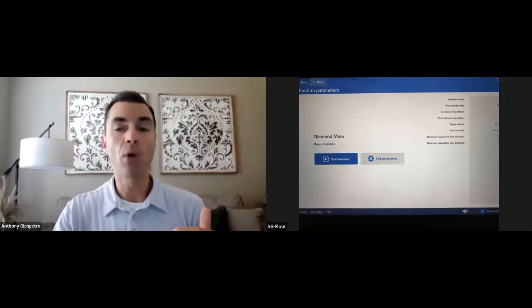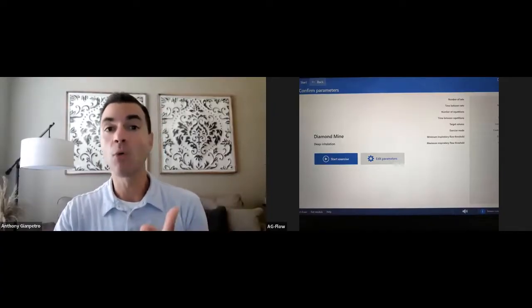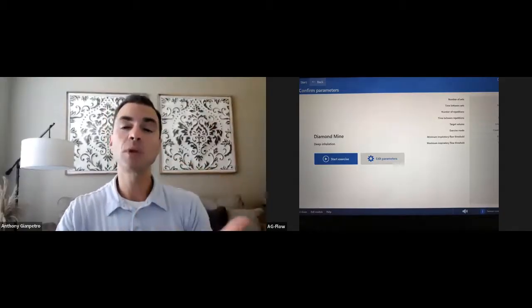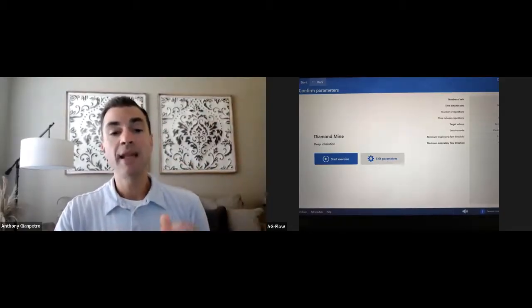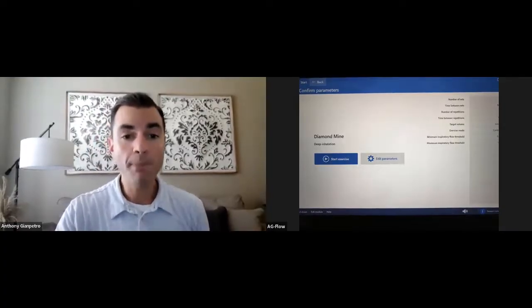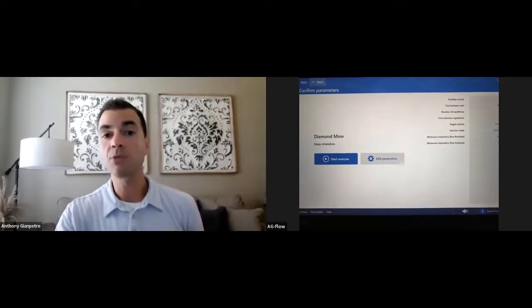And if you need a little more clarification on what minimum threshold and control flow are, which is minimum threshold for inspiration and maximum, it does a really good job showing all that. Now, finally, we have a really good one-page reference that I just want to show you since we went through all of this. This should also have been provided to you.